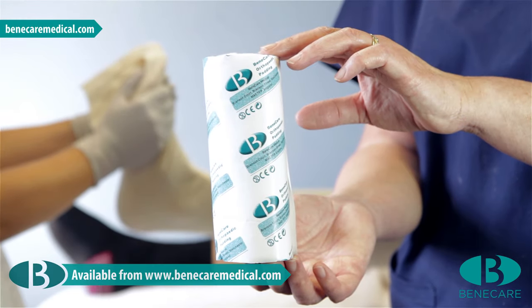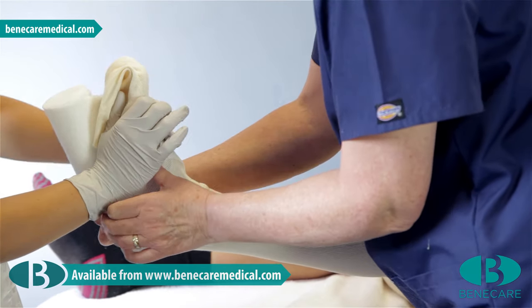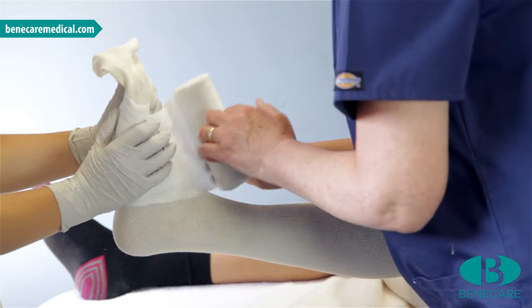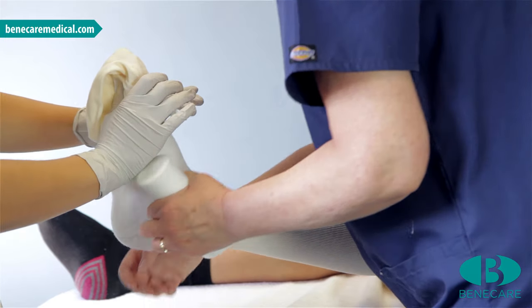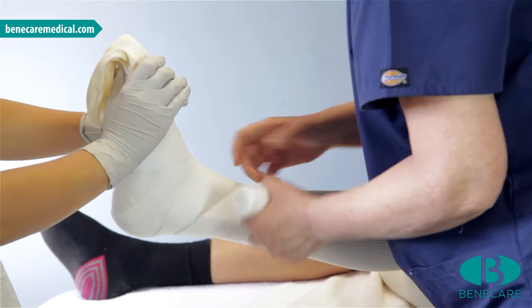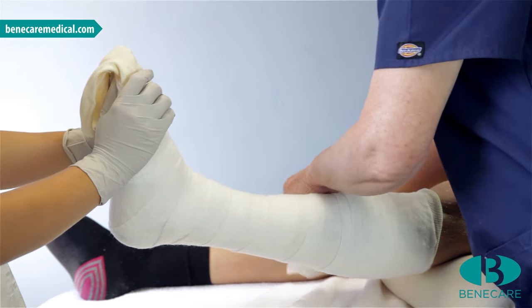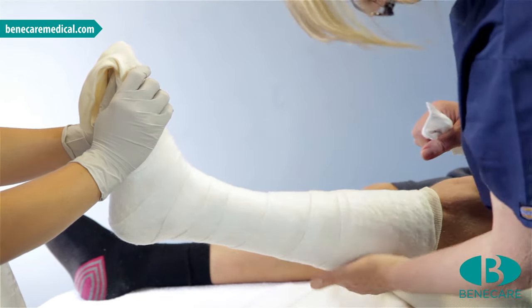Using the 15cm undercast padding, start to wrap at the base of the toes with a double covering. This will provide sufficient padding to be folded for a soft edge to the cast. Keeping the roll close to the limb, continue wrapping covering 50% of the previous turn, paying particular attention to the heel, working towards the tibial tuberosity. Complete this procedure with a double turn at the proximal aspect and tear off the roll. This provides the foundation of a well fitting cast.